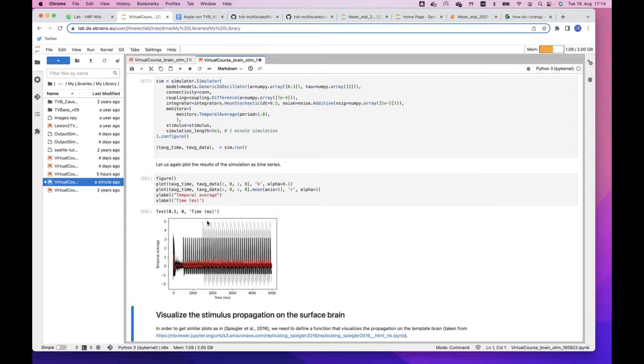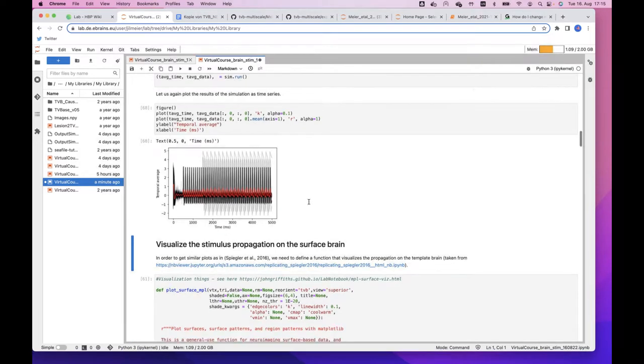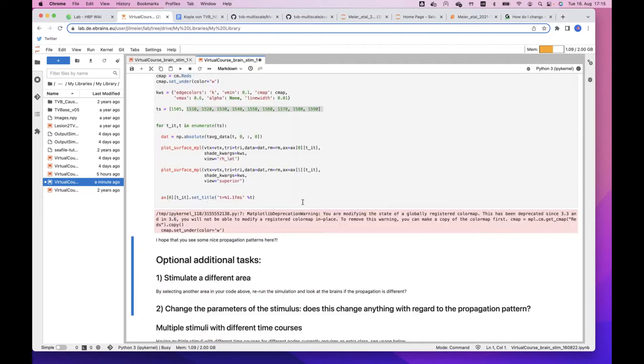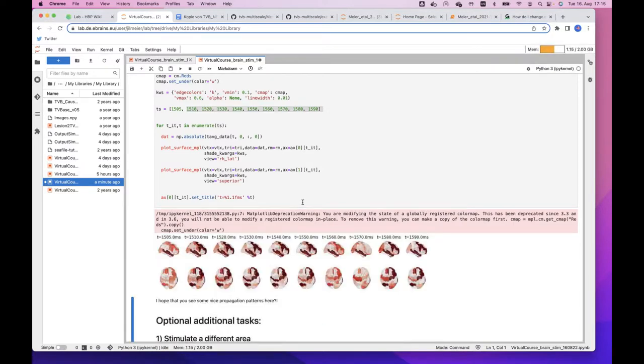Okay, and now we have again defined our stimulus, which we just call stimulus again for convenience. I shouldn't do that, by the way, but this is easier. That I can now go up and just find the simulation again. Just define myself multiple stimuli. And I'll just start from here executing again the simulation. Just because I didn't want to put too much code. Ooh, and you can see, okay, if we have multiple stimuli, there's a lot of stuff going on. It looks quite different. It changes all the average as well, all the red lines. So let's see how it looks. It should look massive. Again, we just execute and we wait.